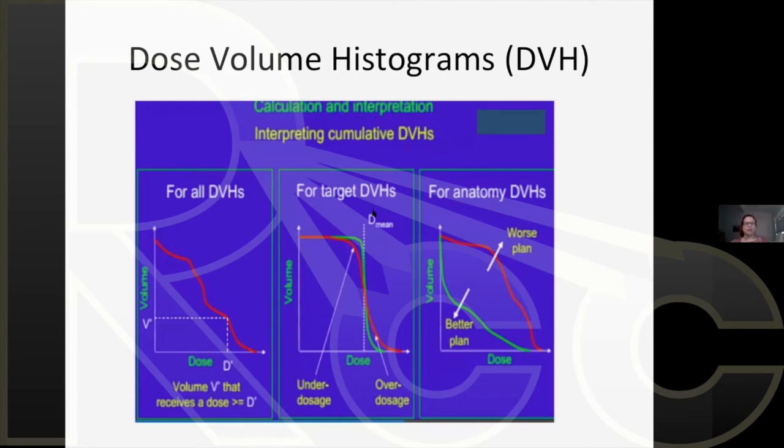Frank, maybe you can also speak to the topic of if you've got your coverage and you have to choose between two plans with DVHs where one has a much lower maximum dose for the OAR, but more low dose to the OAR, versus a plan that has kind of a similar gradual fall off, but has a much higher maximum dose to the OAR. What sorts of considerations would you keep in mind when picking the better plan in that case?